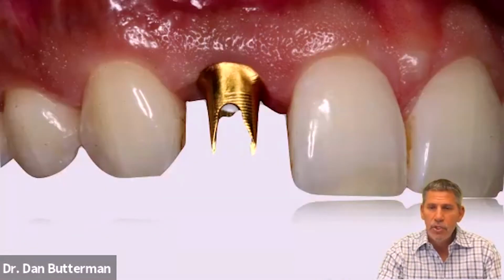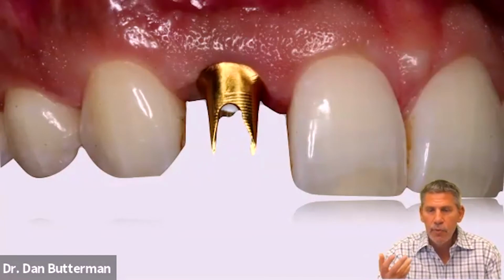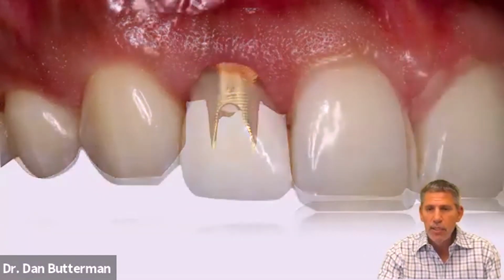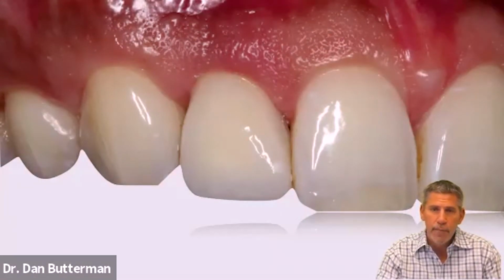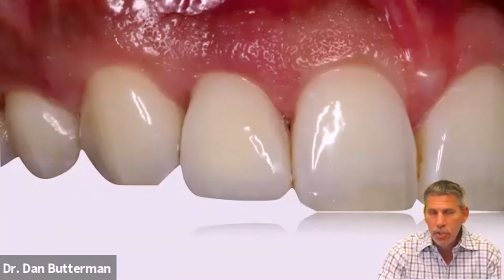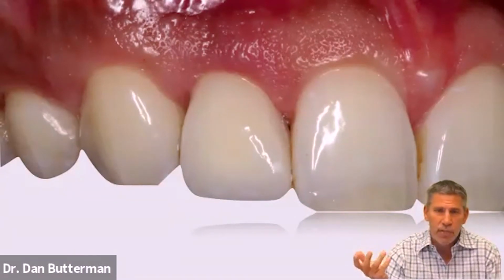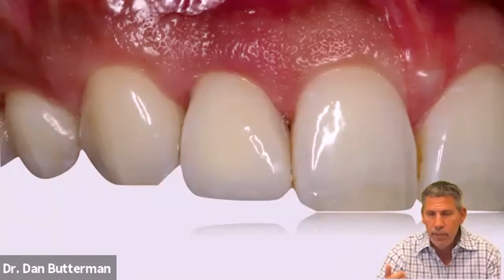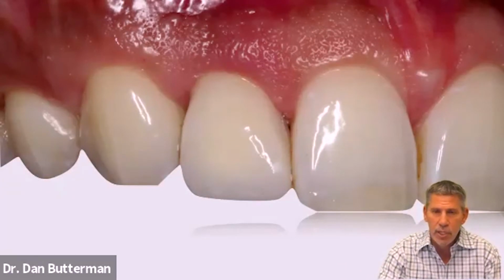do that. So we've removed the temporary, and we now have the new abutment that was made, and we've torqued that in. And then here is the crown that was designed and manufactured, and it looks pretty good. Now, in all honesty, this is the second crown. I made two for this patient because I had the core file, I had the ability to do that. Kind of a big advantage of milling it in-house as opposed to sending it to a lab, because the cost of a block for me to make a crown was about $23. So I tried two, and I just chose the one that I like better and that the patient liked better.